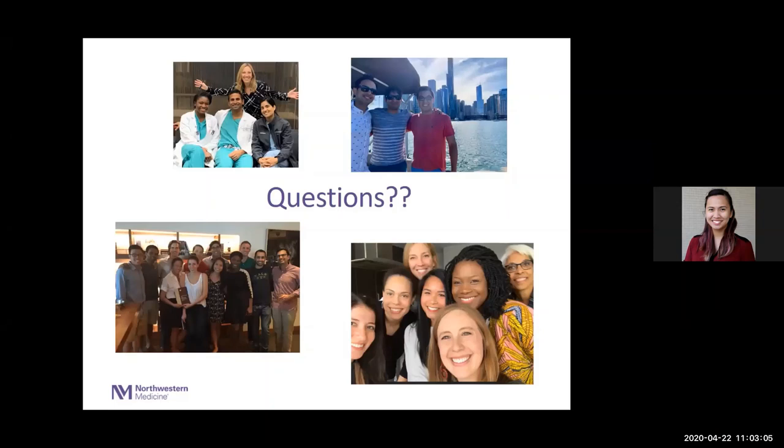We could take the catheter out, step out of the room. Sometimes that helps. Sometimes we'll pull the curtain, and if I really want to get a fluoro shot, for instance, I'll step behind the curtain and we'll try to be quiet, run the water, and give the patient something to drink. Sometimes if you really want that voiding phase, you just have to be patient.